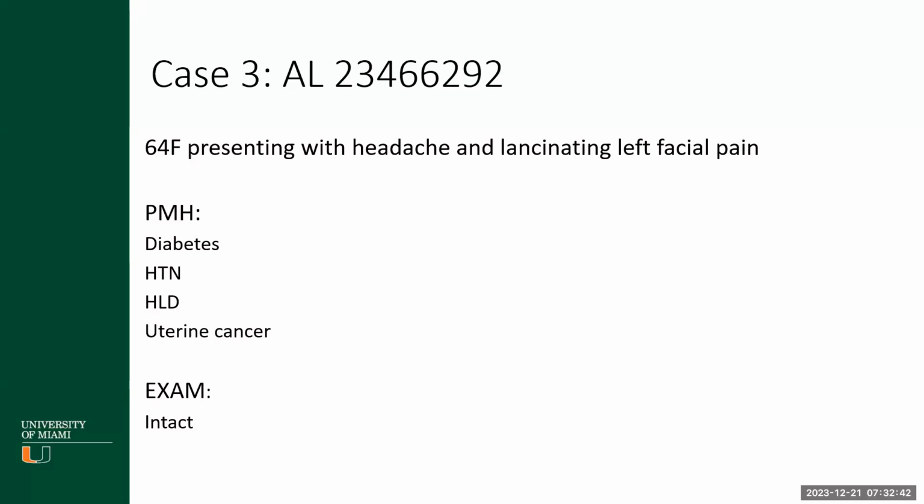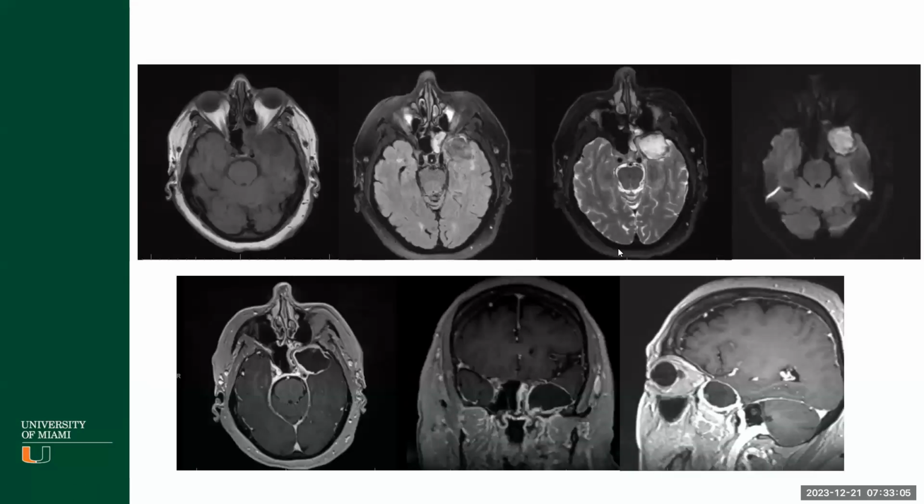Good. You said mandibular for V2? Maxillary for V2. V2 is maxillary. Perfect. Very good. Exactly. So you're thinking potentially something in the left skull base. With your context clues of this being a neuropath case, this is probably a cranial tumor, probably somewhere in that general region. Yeah, I think that's fair. But let's hypothetically say you did not know any of that and you got this. What are you looking at?